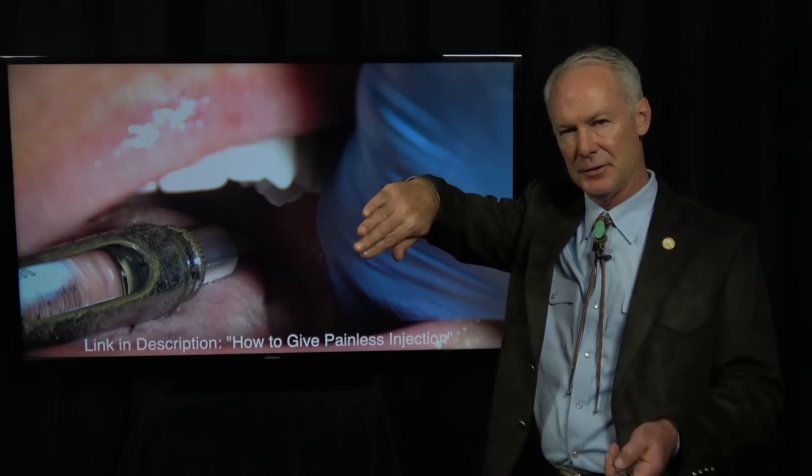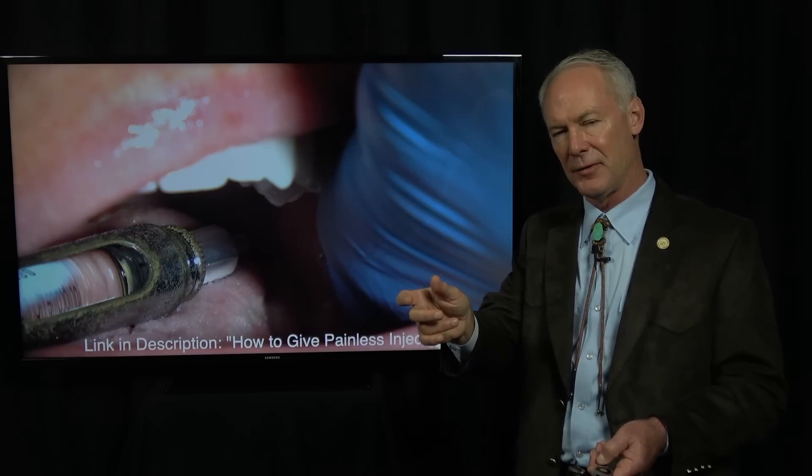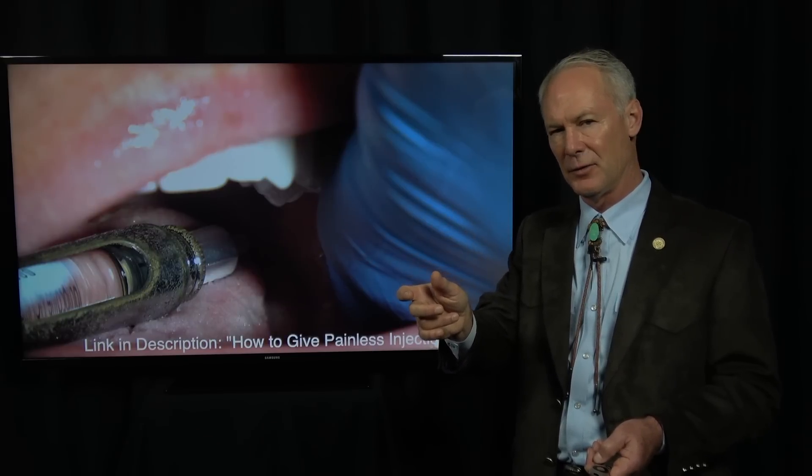Place the bevel of the needle toward the tooth and very gently place it in the sulcus. You're going to use Citanest plain, which is pH neutral, and just apply gentle but firm pressure for about 20 seconds. You want that tooth to be dead numb.